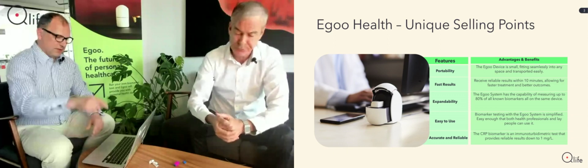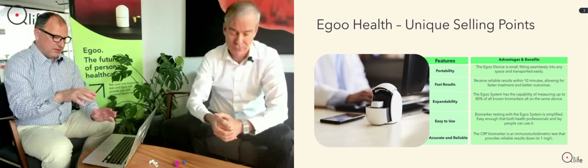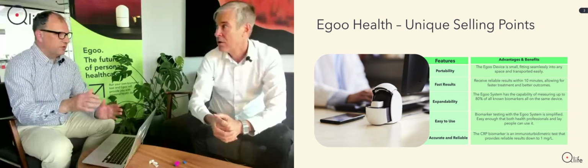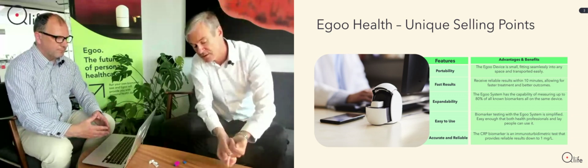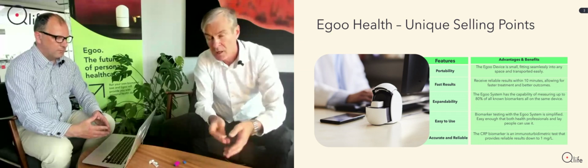For sure. There's actually a question here from the audience about the whole testing process. Sure. Now you use your little finger. Could you use the long finger as well, or should it be the little finger? You could essentially use any finger. The reason for using the little finger here is because it fits nicely to where I'm sitting. But you could use whatever finger.